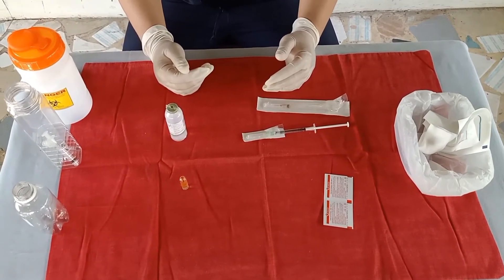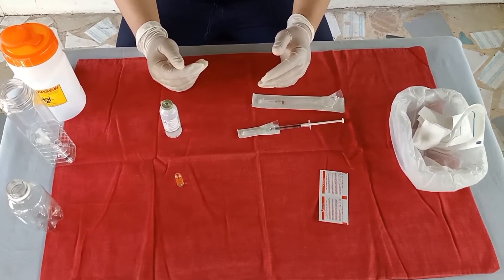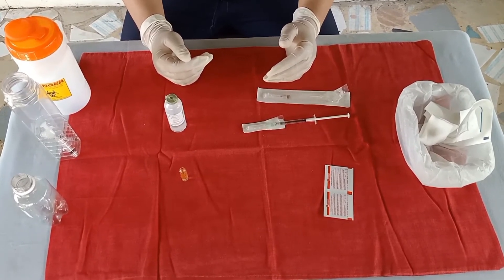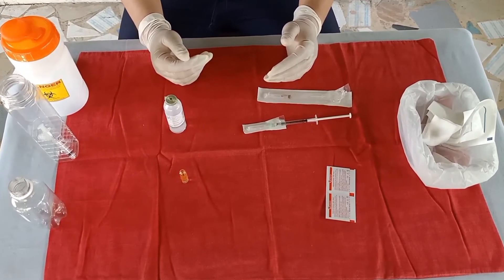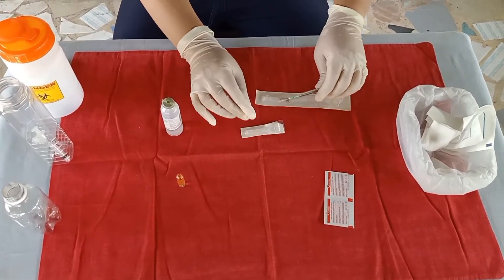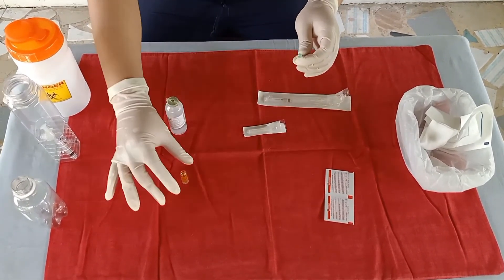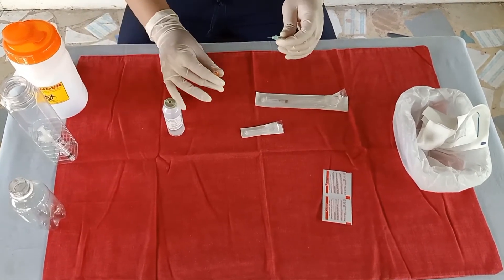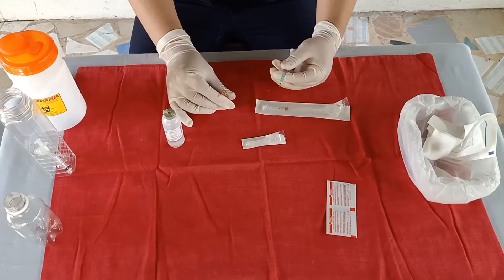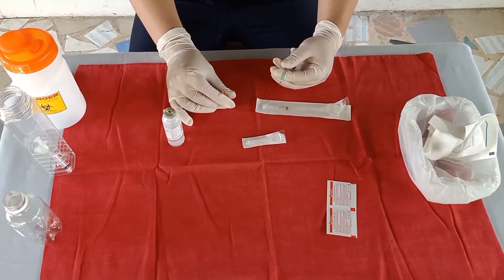Remove the cap from the withdrawing needle and insert the needle into the center of the ampule. Do not touch the rim of the ampule with the needle tip or shaft. Withdraw the amount of drug required for the dosage by inverting the ampule.